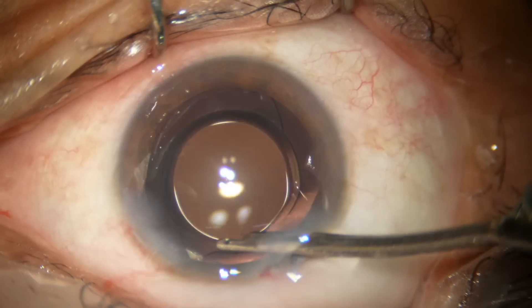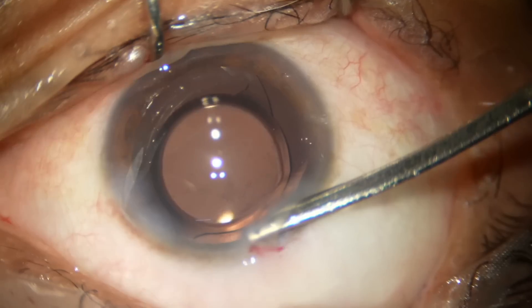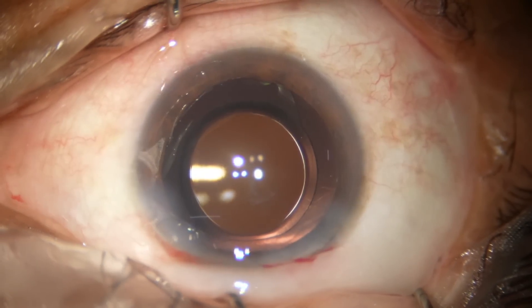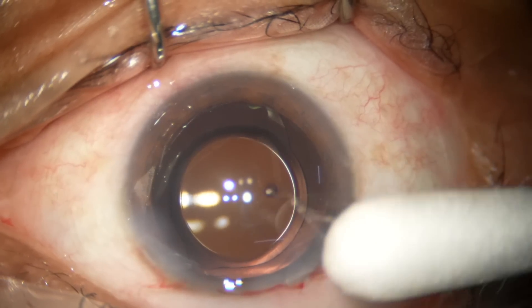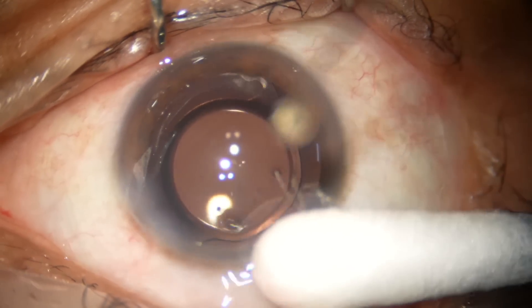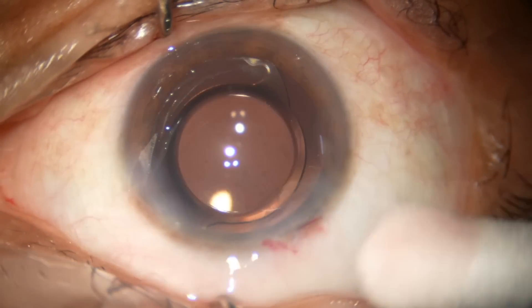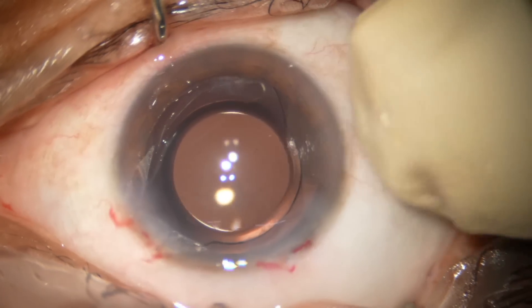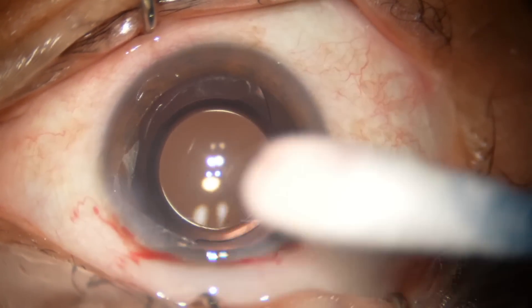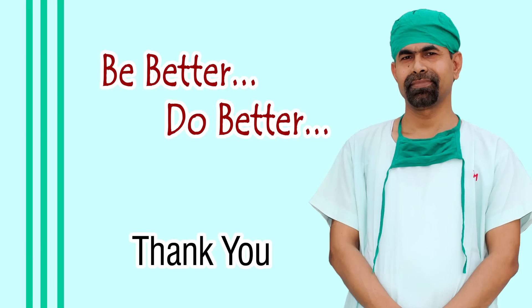See how to form the anterior chamber — you occlude the main wound completely like this. Now check if there is any leakage from the wound or not. There is no leakage. A few drops of moxifloxacin have been applied over the ocular surface. No leakage, intraocular pressure is firm — on the higher side. And we conclude the case. Thank you very much for your attention.